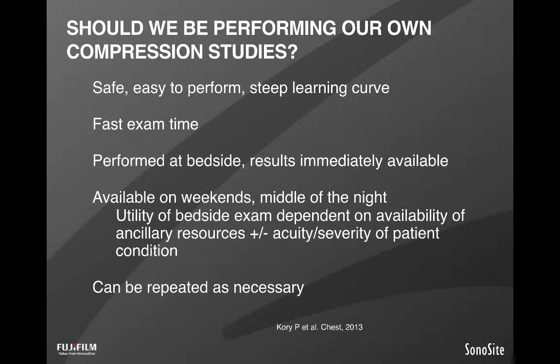The utility of doing it ourselves is really almost incalculable in many institutions. Again, if you're at an institution that can have immediate response from the sonography or radiology or vascular department in providing a sonographer who can do this study within minutes, well then maybe the utility of learning this won't be so high.